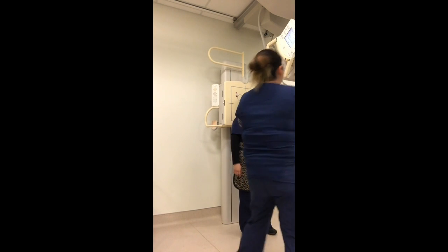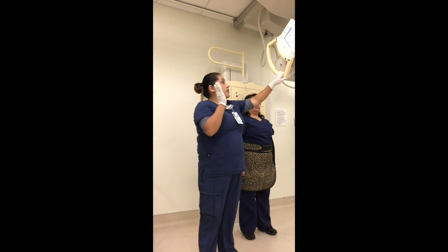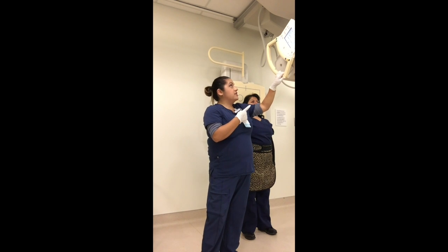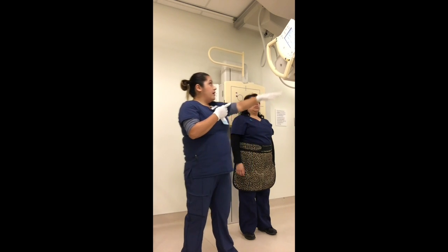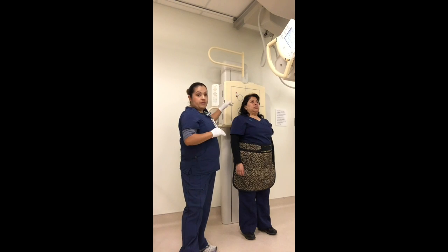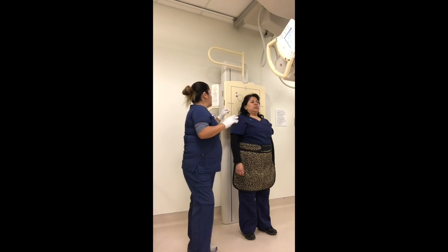So the next image we're going to do is the AP axial Towne's method. And I'm going to start by angling my tube at a 30-degree caudad angle. I'm at 40 SID. The IR is going to be 10 by 12 lengthwise.